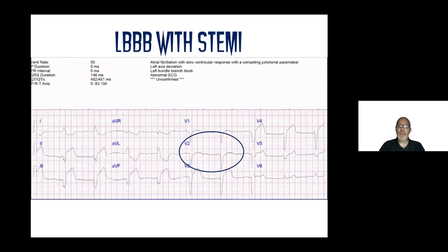So the next thing I'm looking for is excessive discordance. In other words, is the amount of ST elevation in any one discordant lead 25% or greater the size of the QRS complex? And as it turns out, you see it in multiple leads. If you look down here in lead 3, here's your J point. This is all ST elevation, and your S wave is not really that deep, so it's basically about 50% the depth of your S wave. I could say the same thing about lead 2 and lead AVF. I could say the same thing about lead AVL, because AVL is also discordant: the QRS complex is going up, but the ST segment's going down. If I measure that ST deviation, that's easily greater than 25% the height of that R wave.